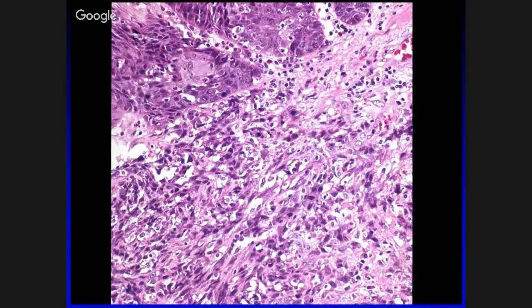You don't necessarily need to do immunos, but generally we do. Does it usually have a component of a conventional squamous? No, as I will show you. So the question is, does it always have a conventional squamous component? No, because often they're ulcerated. We won't see the surface. There may not be a differentiated component. And then the immunos can compound that problem, as I'll show you.